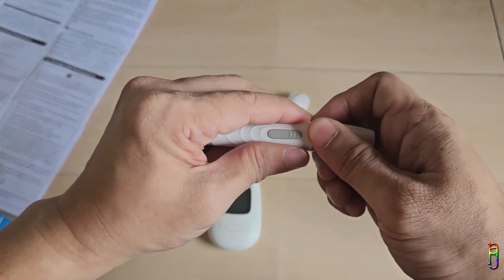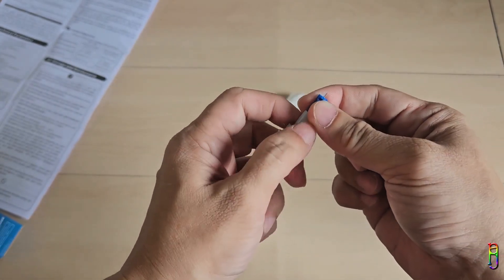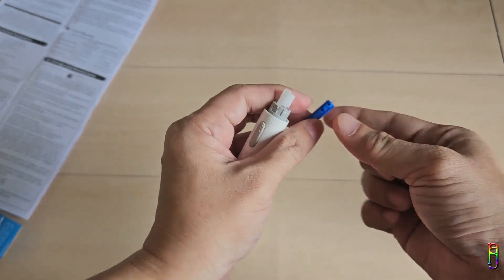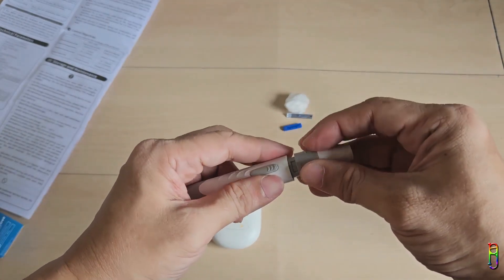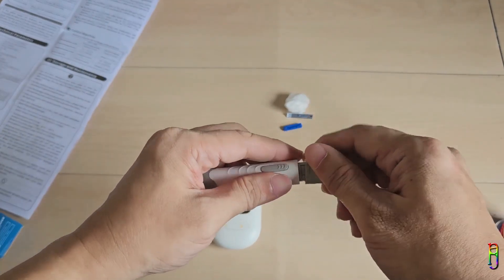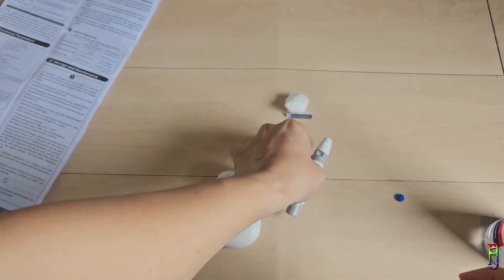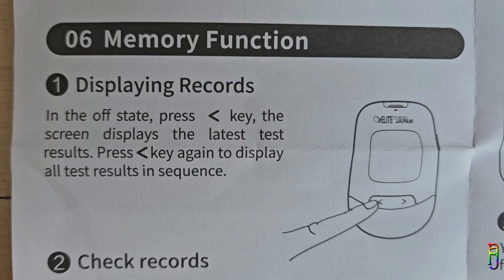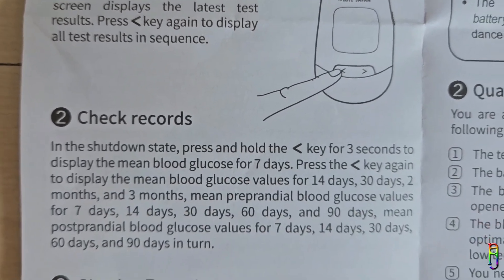After testing, you can use the ejector on the side of the glucometer or simply pull out the strip — I recommend pulling it out since the ejector is a bit too forceful. Don't forget to remove the lancet from the lancing device as well. This is very important, especially if other people will use the lancing device, as we don't want to spread any diseases. Both the testing strip and lancet should be disposed of properly, then return the glucometer and lancing device to the case and keep it safe.